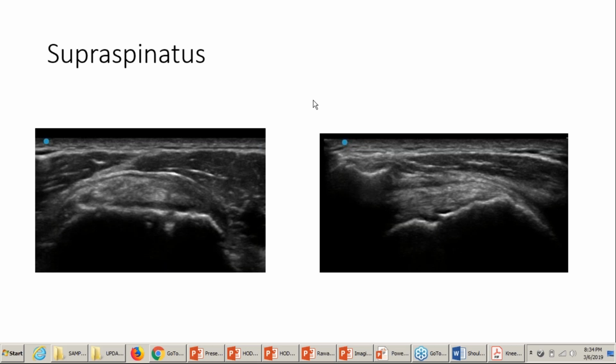So I will also look at what type of history the patient presents with, if there is any recent traumatic mechanism or any recent exacerbation of symptoms, if my sonopalpation at this area generates pain, or if they complain of pain. I do a lot of sonopalpation to clinically correlate, because if you're imaging someone's 50, 60 plus shoulder, there is always going to be something wrong there, but that doesn't mean that that's the source of pain. So make sure when you find something abnormal, you try sonopalpation, you ask more questions. So I have to do more than that to say that.